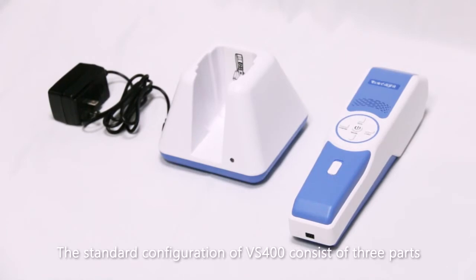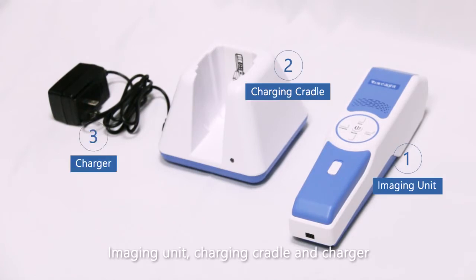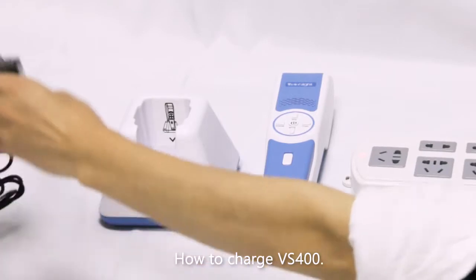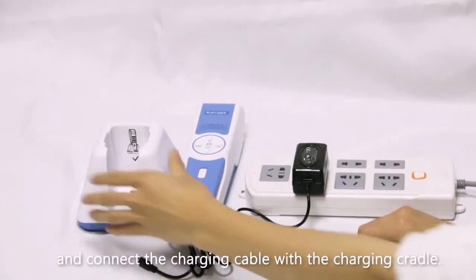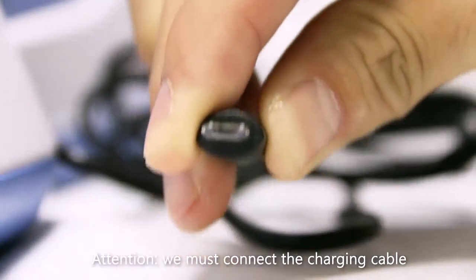The standard configuration of the VS 400 consists of three parts: imaging unit, charging cradle, and charger. To charge the VS 400, connect the charger with AC power and connect the charging cable with the charging cradle.